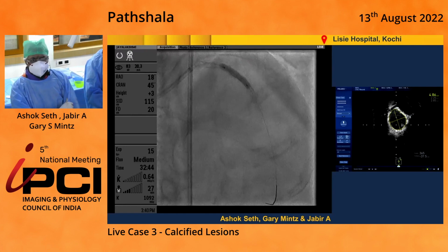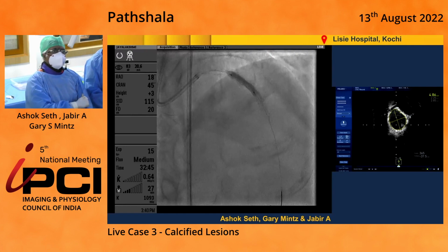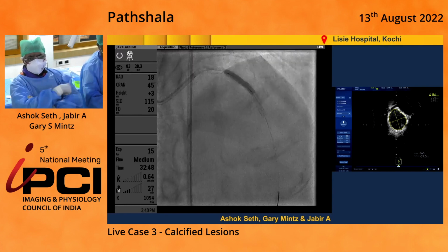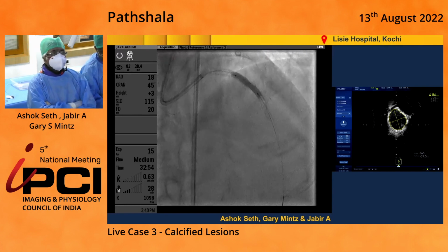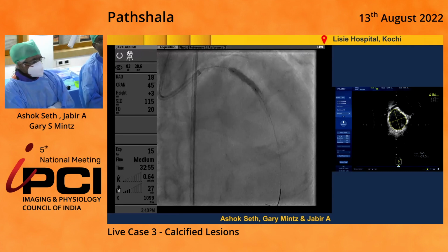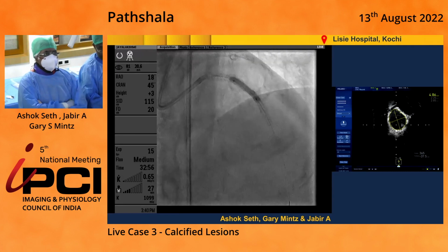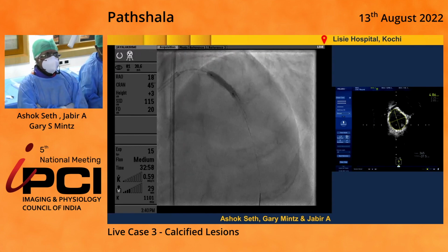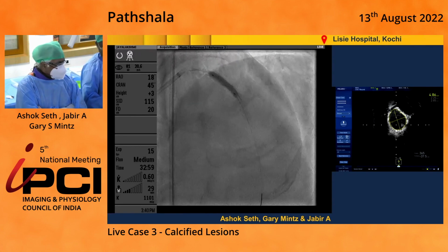Z, I wanted to ask you, is 80 pulses good enough? Maybe 160 pulses could be better. Do we have any understanding around this aspect? For such, 80 pulses was totally arbitrary. That's right, totally arbitrary. And so once you do the FDA testing with 80, that's your number. That's how many you get.